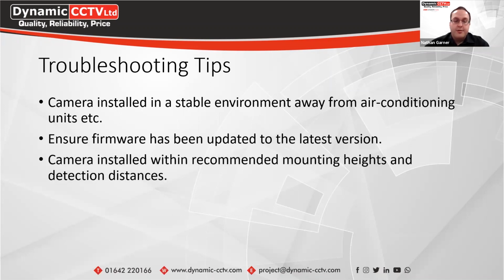The cameras also need to be installed within the recommended mounting heights as well as the detection distances. I've seen in the past where larger lens bullet cameras were being used, but the actual detection distance the customer required was really short. So this was affecting the accuracy of the temperature readings. So it's just making sure that you use the right mounting heights as well as detection distances for the camera that you've got on site for the solution.